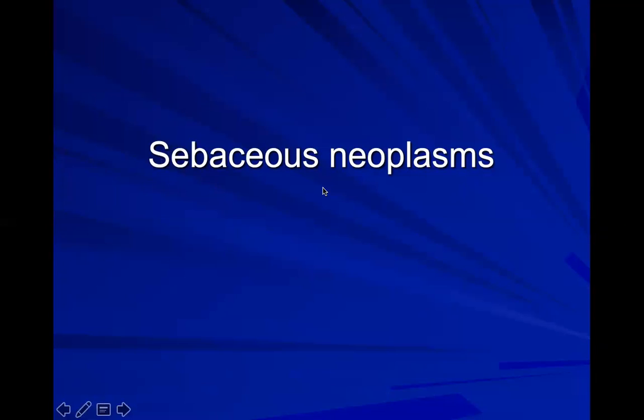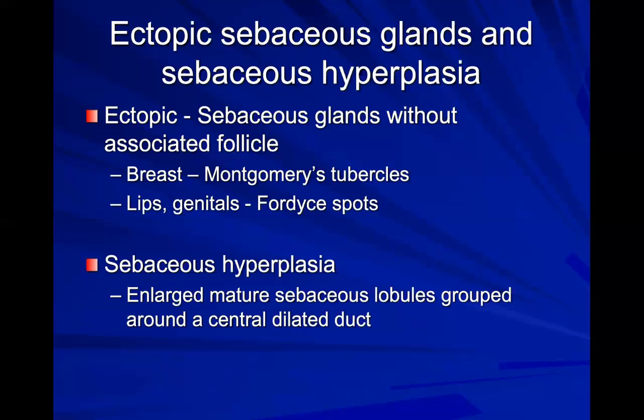Okay, enough on follicular. So now we go to sebaceous. A lot of people don't agree on how to define these, but I'm just going to go through a basic framework of things that most people would agree on. And then I think that you won't be tested beyond that.